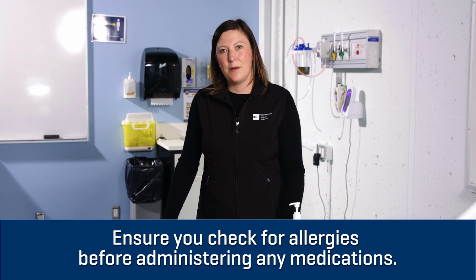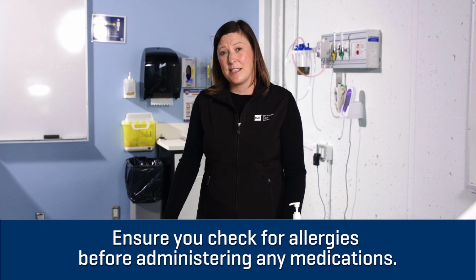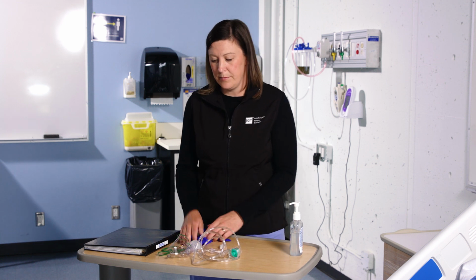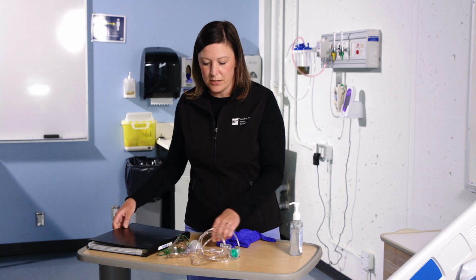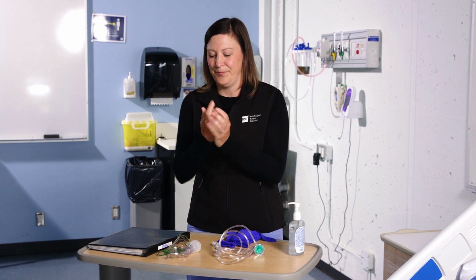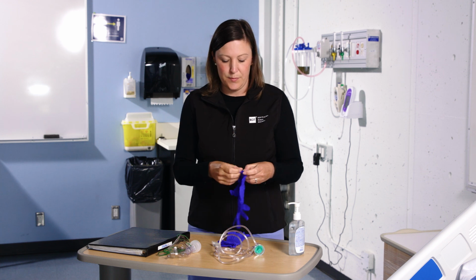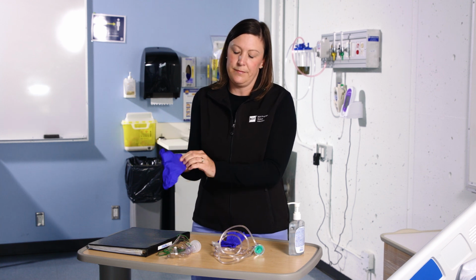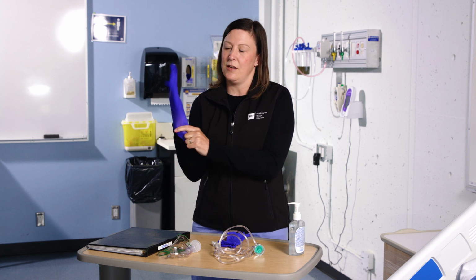Hi, Mrs. Jones, I'm here with your salbutamol. I'm now ready to pour my medication. For the sake of this video, I've completed the second check of the 7 rights off camera, and I'm ready to pour at the bedside. Everything was accurate. So I'm going to start with sanitizing my hands. I'm going to put on gloves because I'm going to be handling a medication and I don't want any to get on my skin.